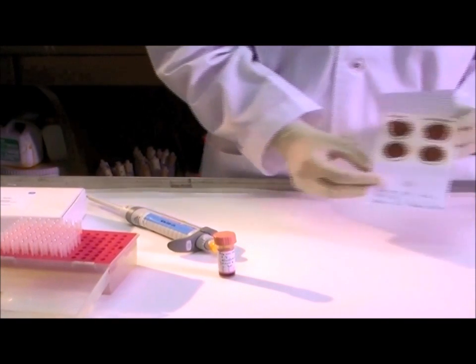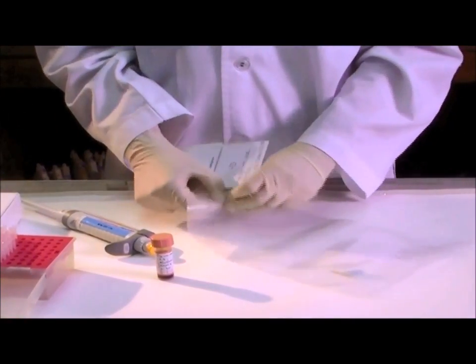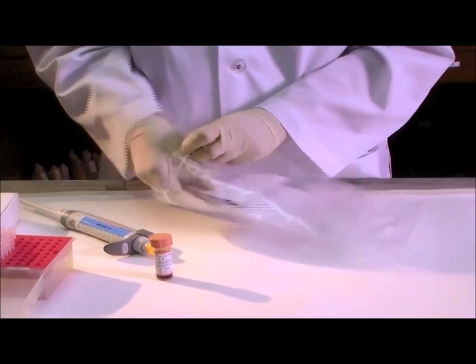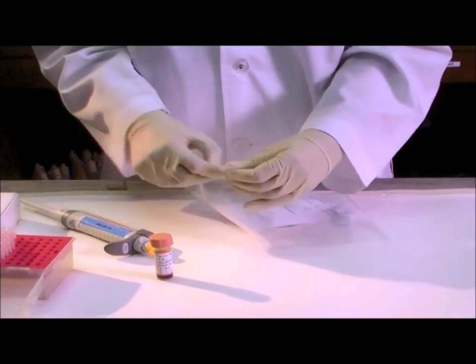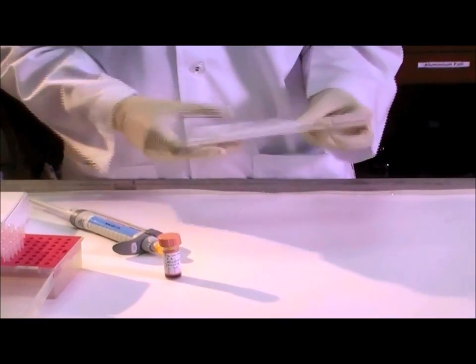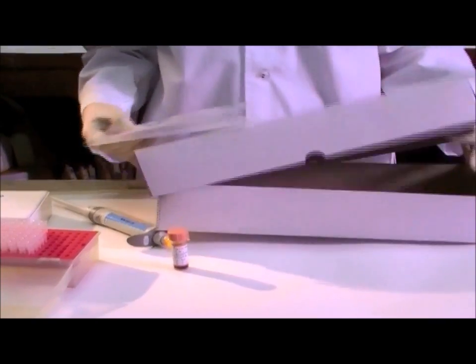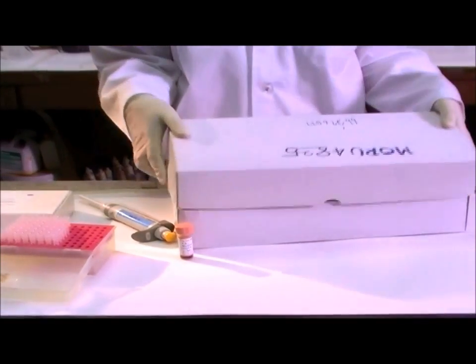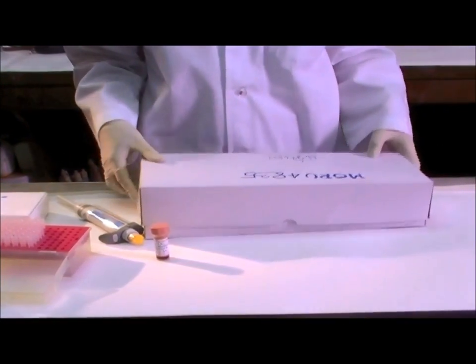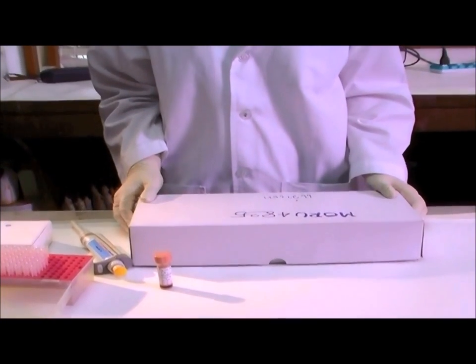After drying, seal the card in a zip-locking bag with a desiccant pack. Store cards in a cool, dry, dark place. Do not refrigerate or freeze, as this can allow moisture in the form of condensation to enter the bag.